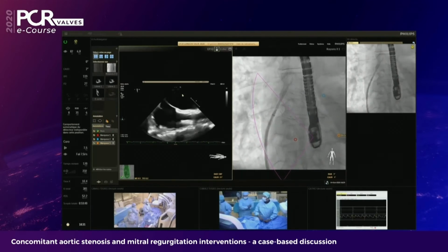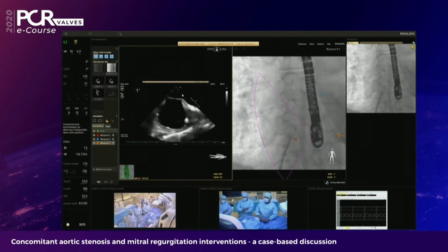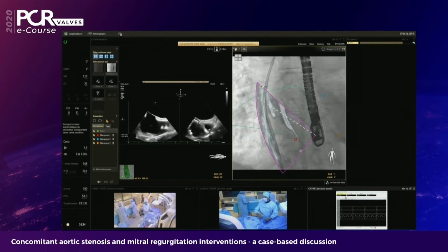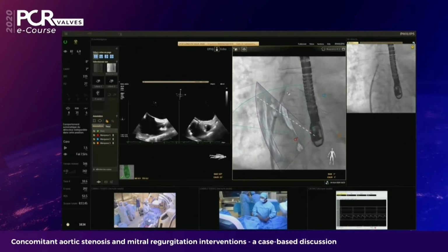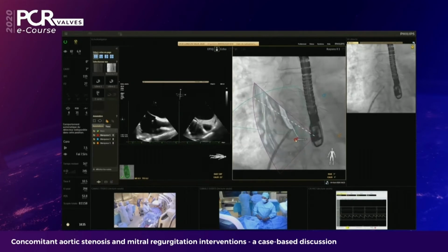Now we're ready for the transseptal guidance. This guidance will be performed through a combined imaging modality. What we have from the Philips system is the Echo system, EPIQ CVx, and the fusion, which is obtained with the EchoNavigator. On the screen you can see some dots coming from the fusion view. I have the echo superimposed on the X-ray. And obviously it's very easy to look at this fusion imaging, and you see that the red dot is the fossa ovalis area, which should be the best target for the puncture.